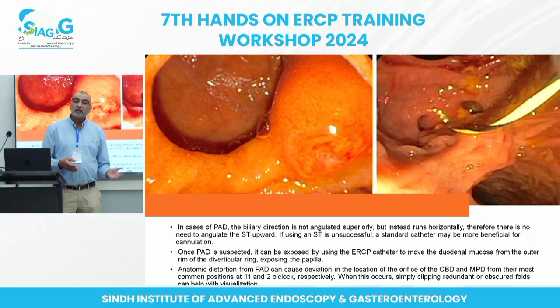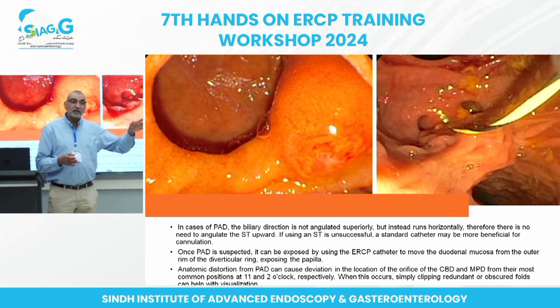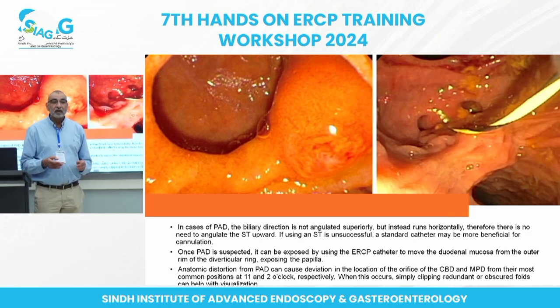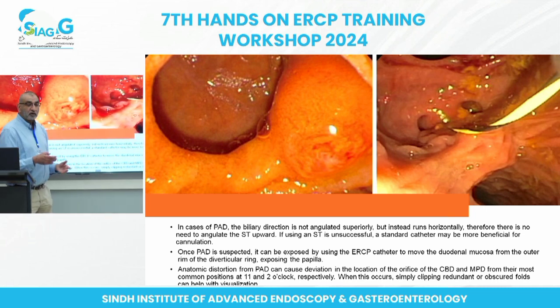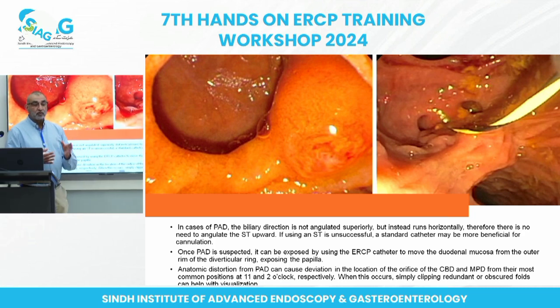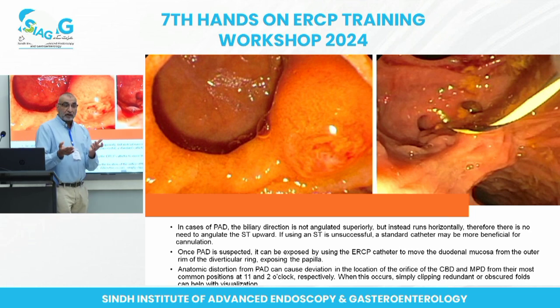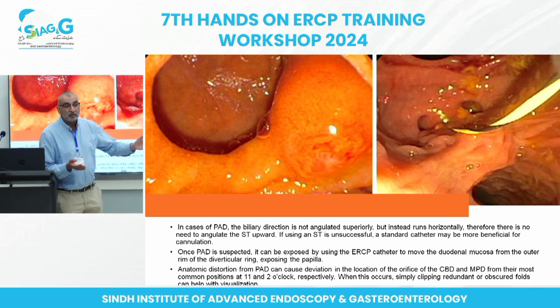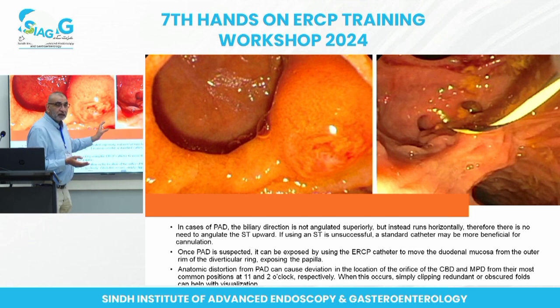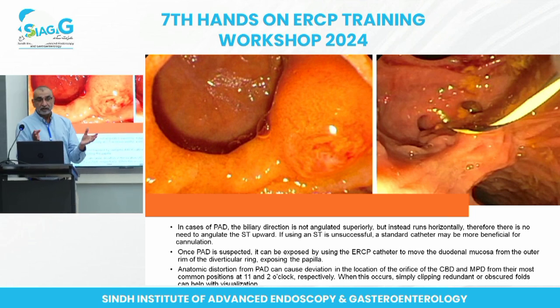There's nothing here. The only issue is when you are doing a sphincterotomy, there's a higher risk of causing a perforation. And as Dr. Sarisha was explaining earlier, so much so that you should do a very small sphincterotomy and follow it up with a sphincteroplasty. Or even if you are worried, prophylactically you usually put a fully covered stent in. ताकि अगर कोई छोटी मोटी perforation हो भी तो you should cover it, right?